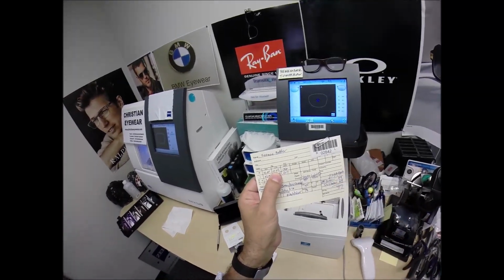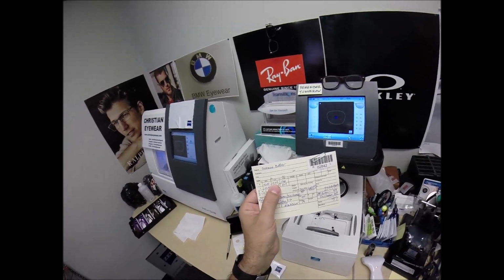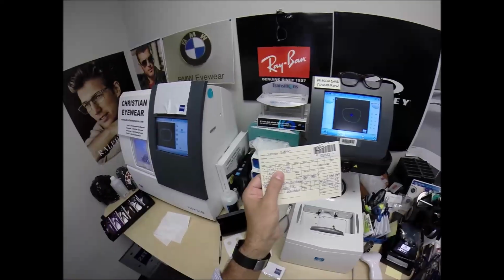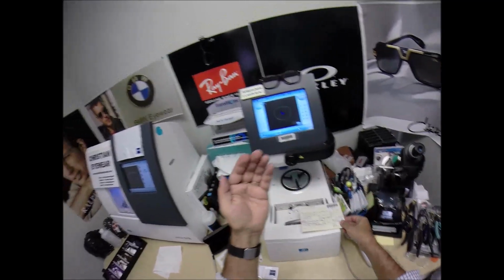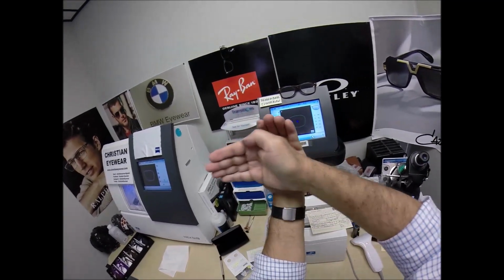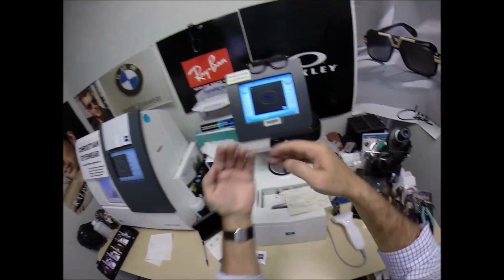of astigmatism correction. Now there is a stigma over the word astigmatism. It just means shape. It's like saying someone has straight hair, someone else has curly hair. Everyone freaks out when they hear that word for no reason. It just means you have a second curve on your eye. I have a +1 here, and then a second curve 90 degrees. If this is the x-axis, this is the y-axis. And I have another curve here that's slightly steeper by 1 step.